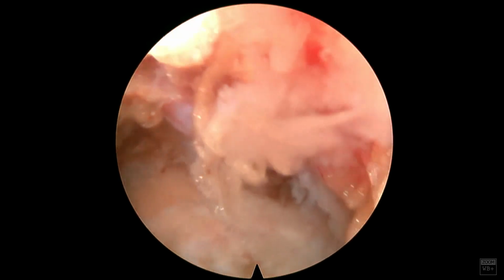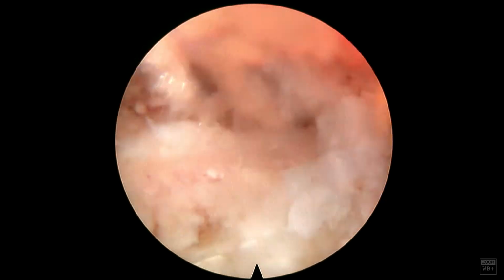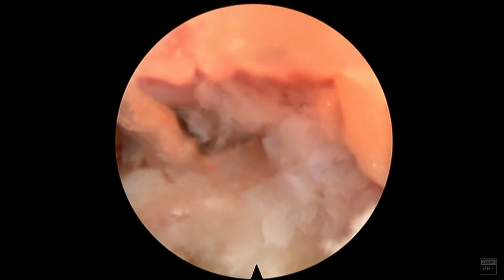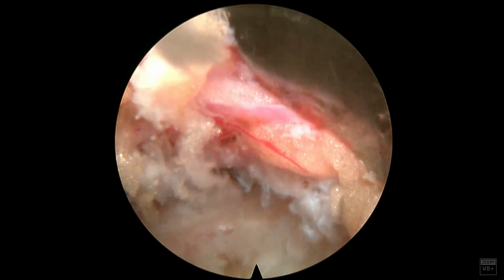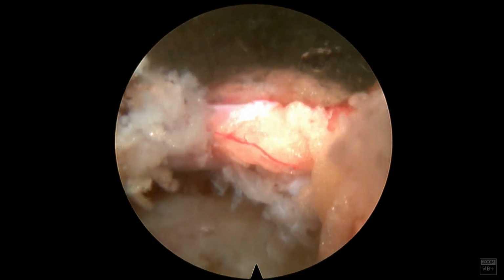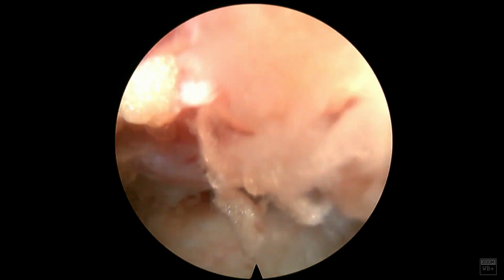I know that his radicular symptoms are most likely going to be gone because he's got a ton of room in here now for the exiting L5 nerve root. There's a little bit of disc right there, and the great thing about the working tube is that I can push the nerve out of the way.